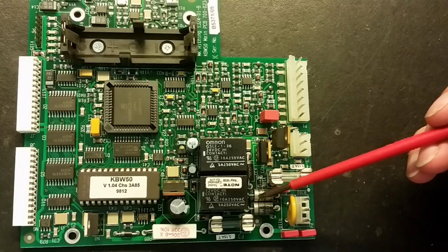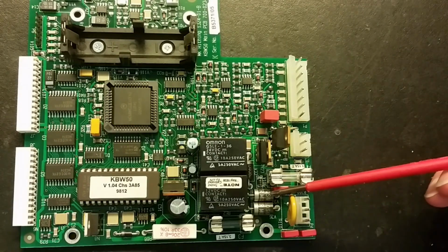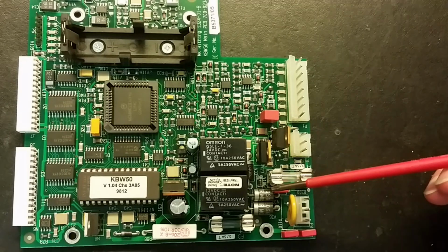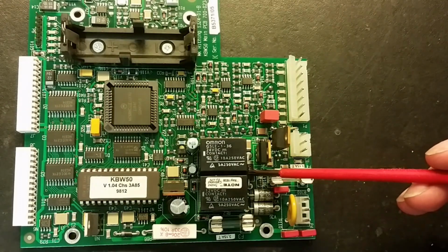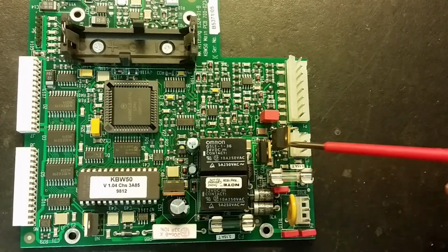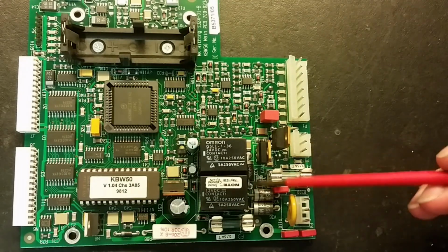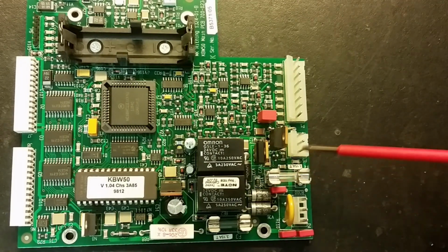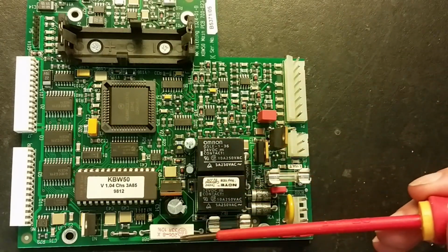We've got a double diode rectification because it's a center tap transformer. Not required the 4 diodes, just 2 diodes are good. We've got a reverse power diode here that prevents the power going out to the battery, I think. I think it's that way. This protects the battery from being charged from this one, because this is not a battery charger, obviously.